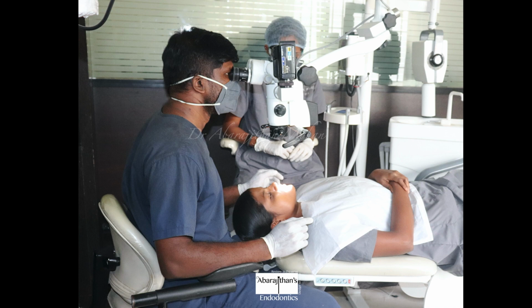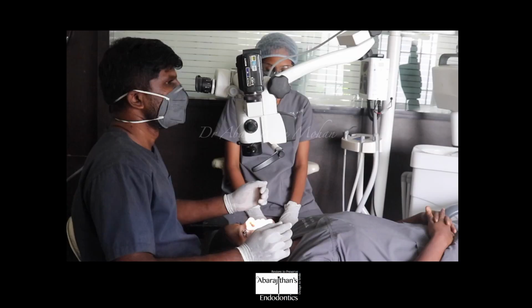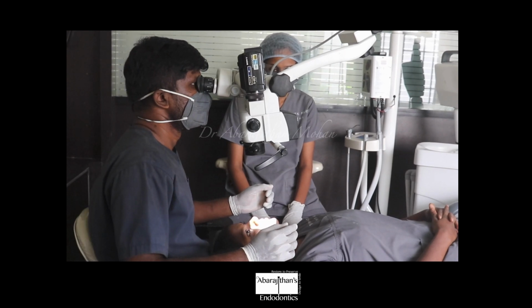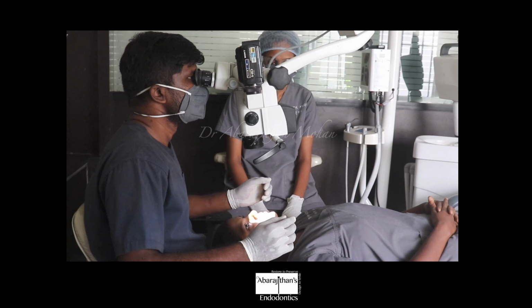But in spite of this, you can see that the operator is not at his best ergonomic posture, because the operator has to bend forward to look into the eyepiece. So this can be generally addressed with having an eyepiece extender in your microscope, or what you can do is, you can just see here, the operator has to move forward, which is not good for ergonomics.